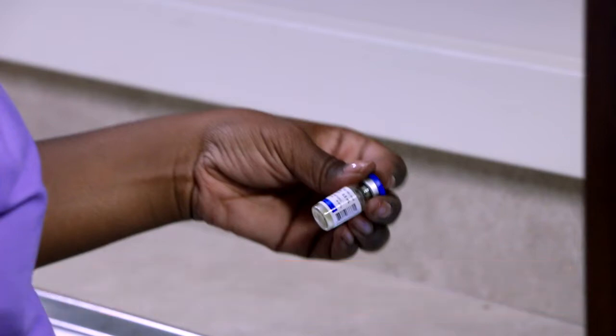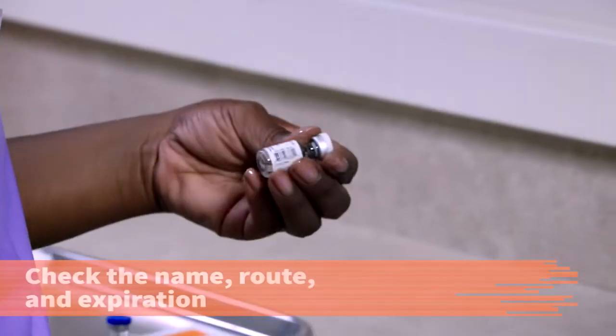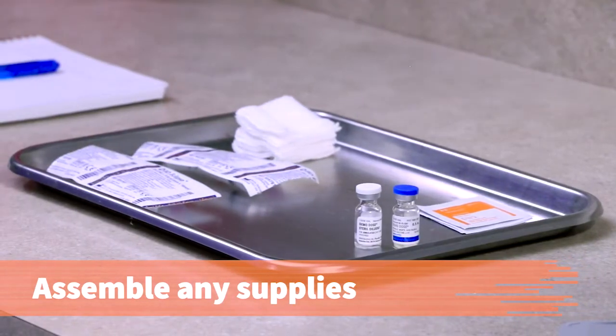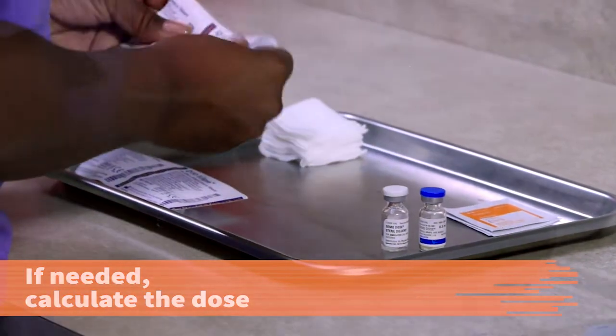Read the medication label to determine the correct diluent. Obtain the diluent and check the name, route, and expiration date. Assemble the supplies required for the procedure. If needed, calculate the dose of medication required.